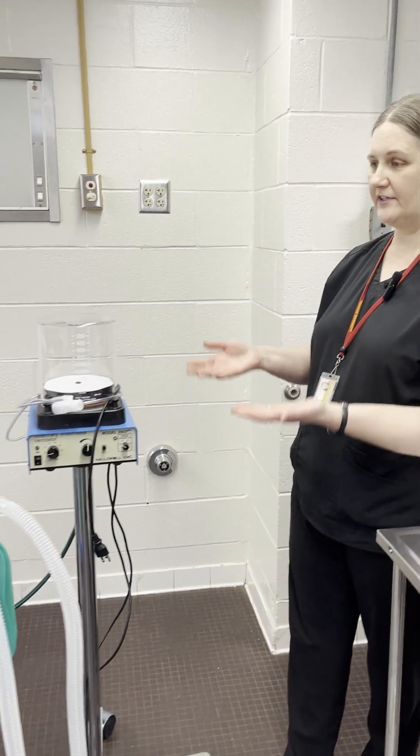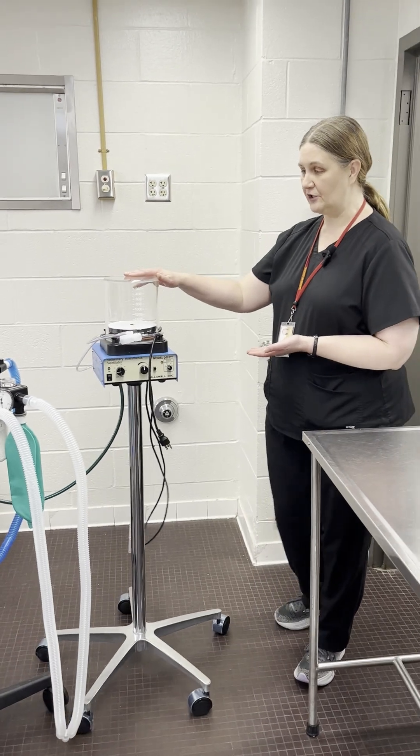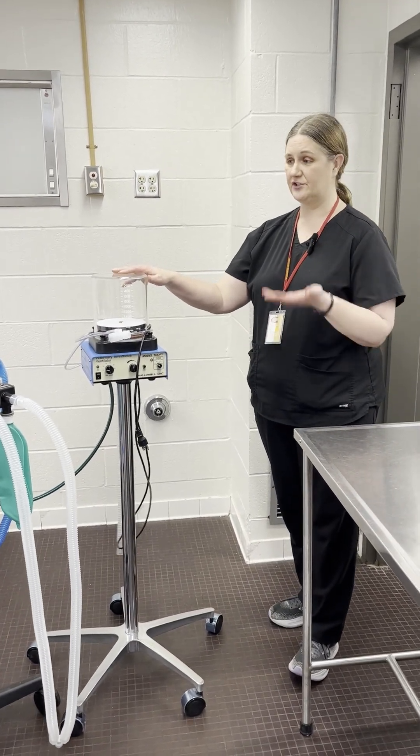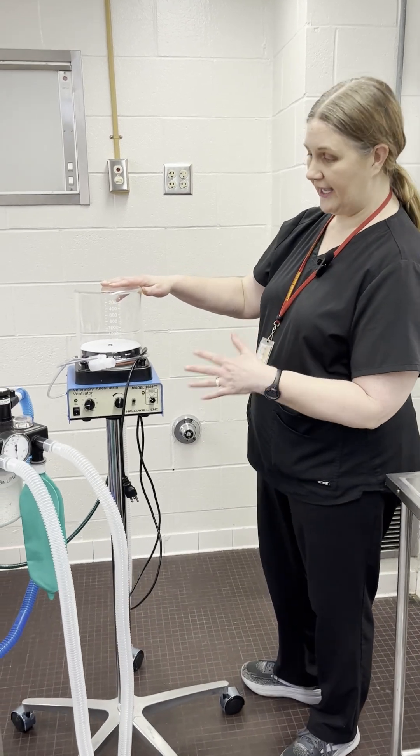Hello everyone, my name is Darcy Palmer and I am here today to show you how to attach a Hallowell ventilator to an anesthesia machine. The Hallowell ventilator is a standalone unit and it can actually be attached to any anesthesia machine. So there are a couple different things that we have to do first.